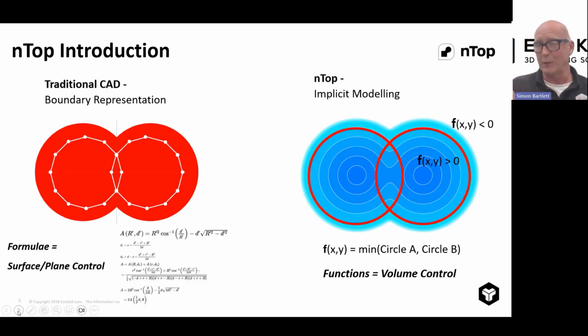So it's surface modeling, and the way that it stitches parts together. What it doesn't do is look at the internal volume of a part. So I can use that to determine and describe a point on a surface, but in terms of that internal volume, that is considered space.